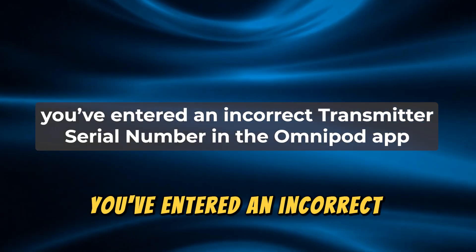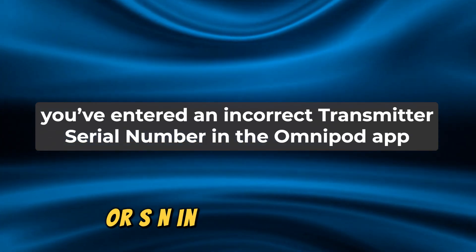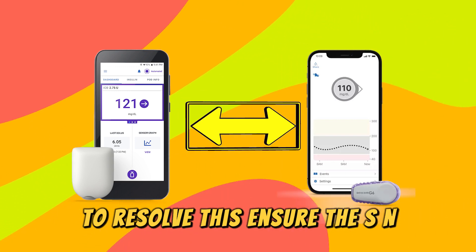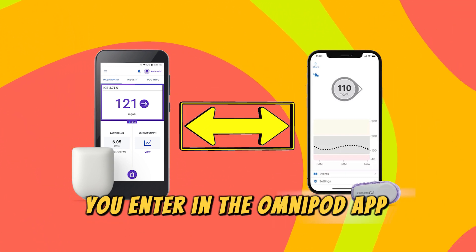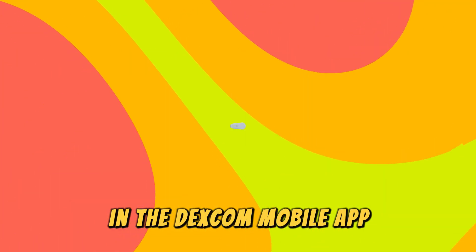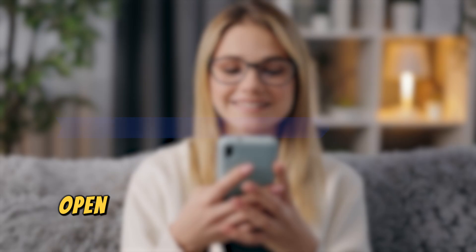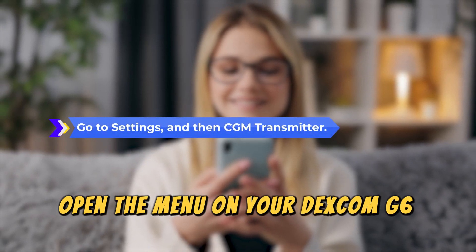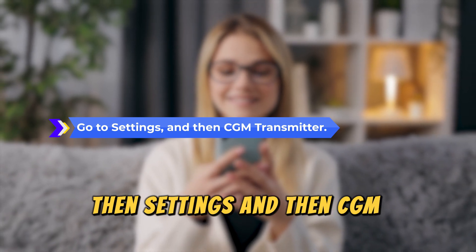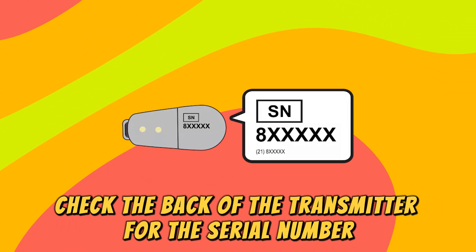First, you've entered an incorrect transmitter serial number, or SN, in the Omnipod app. To resolve this, ensure the SN you enter in the Omnipod app matches the SN in the Dexcom mobile app and the SN on the Dexcom transmitter. To locate the SN, open the menu on your Dexcom G6 mobile app, then Settings, and then CGM transmitter. Check the back of the transmitter for the serial number.